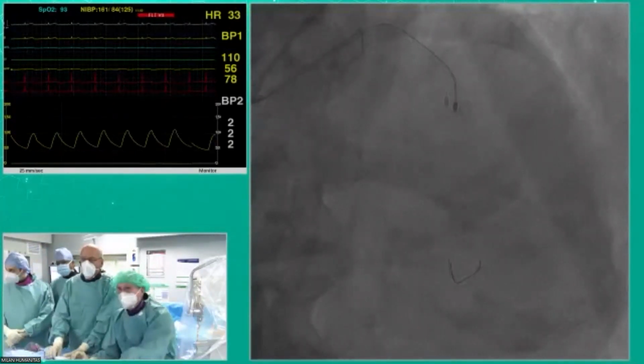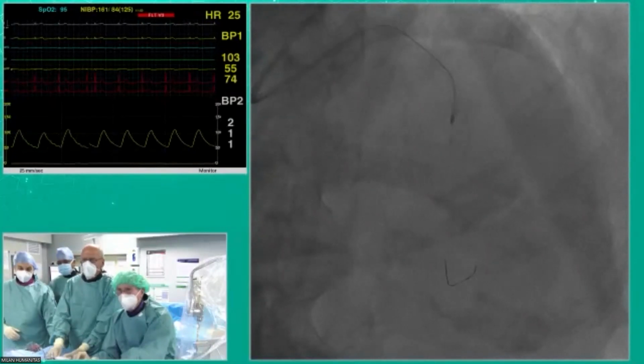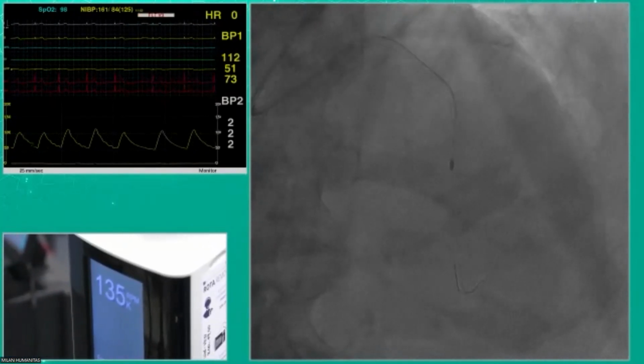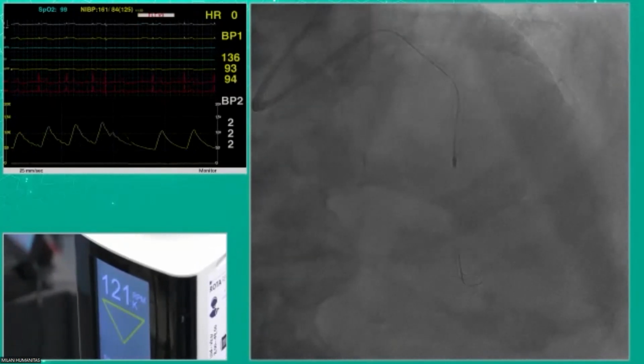And typically, a strategy is a single burr? Yeah, I try to use it. You see it goes down quite a bit? Yeah, it's deceleration. Make this way.